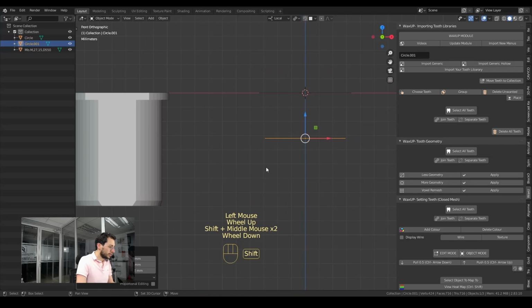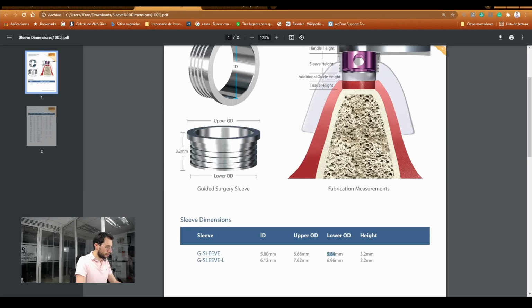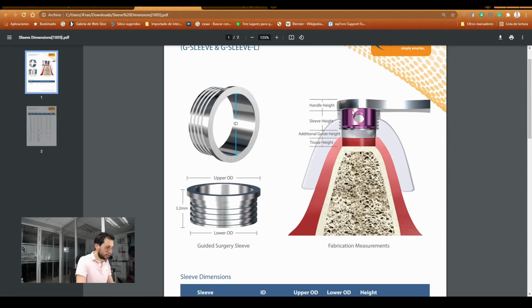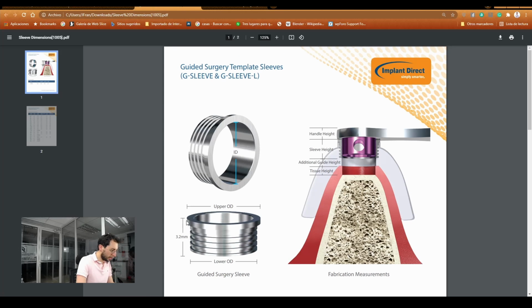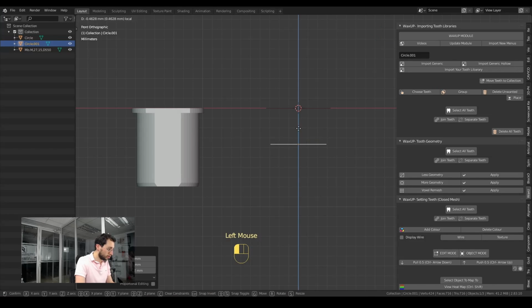However, since this element needs to be bigger, longer, because when I use this cylinder, I need to cut all this structure down here, and it doesn't matter because the cylinder has this step in here, and when you fit the ring in place, it will snap and stop exactly in that step. So it doesn't matter if it is bigger, like this example. So what I'm going to do is to move it like that, okay?